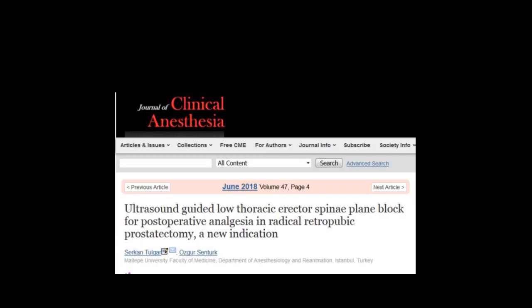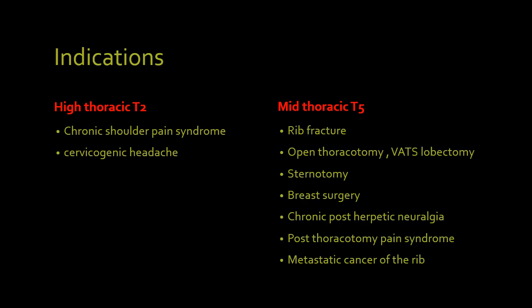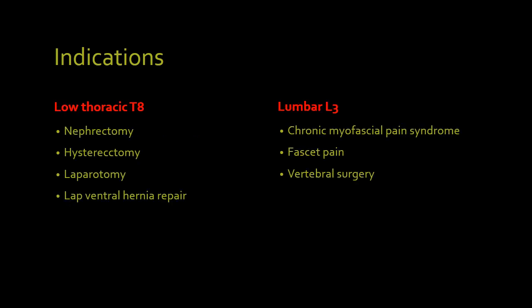For radical retropubic prostatectomy. Based on the above evidence, we can use this block at various levels for various indications, like at T2, T5, T8 and L3.